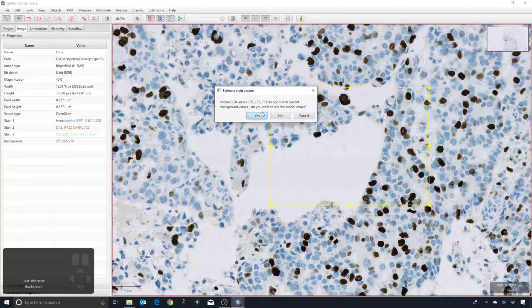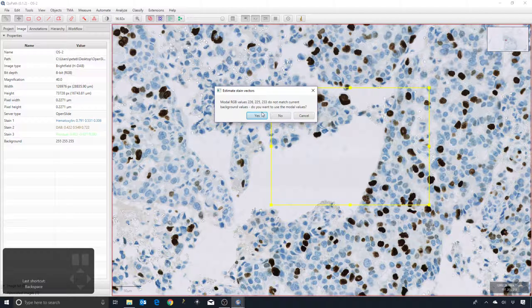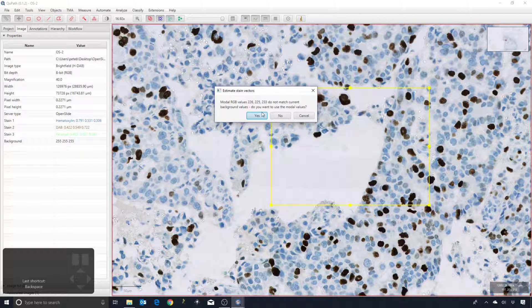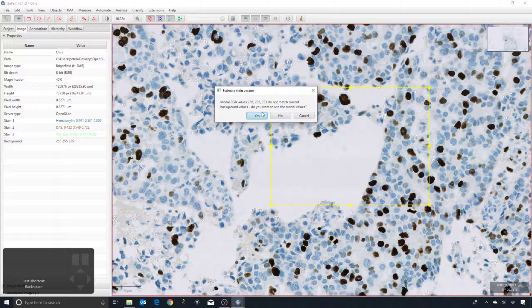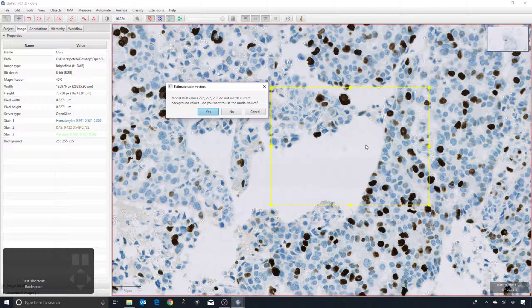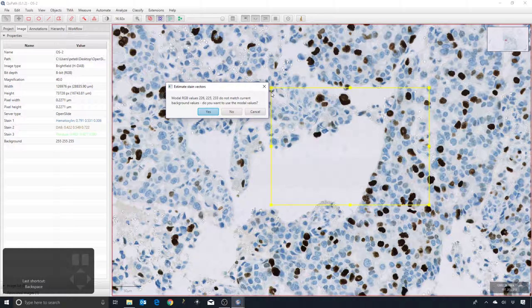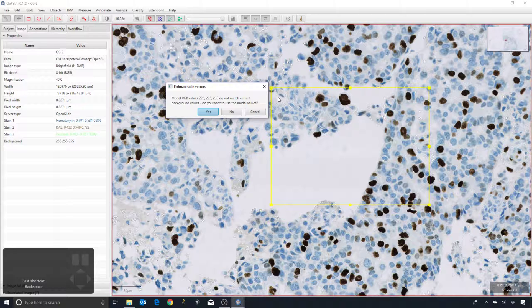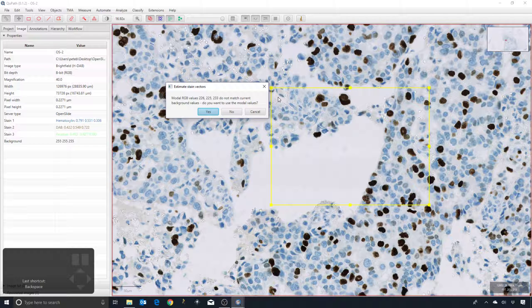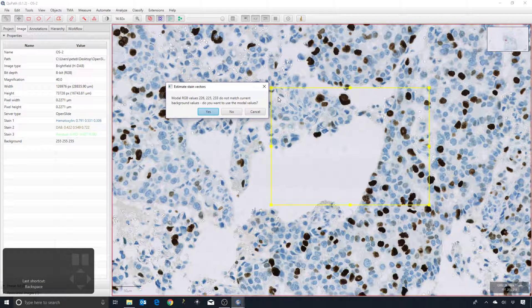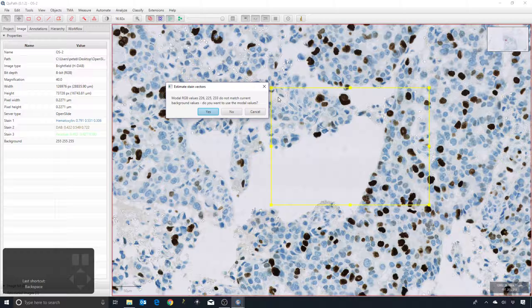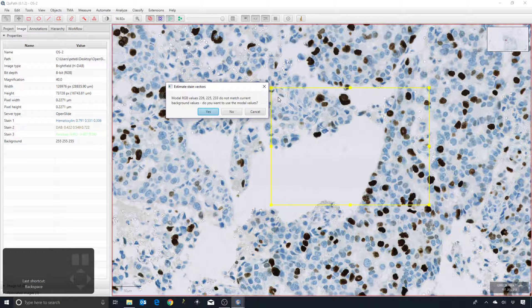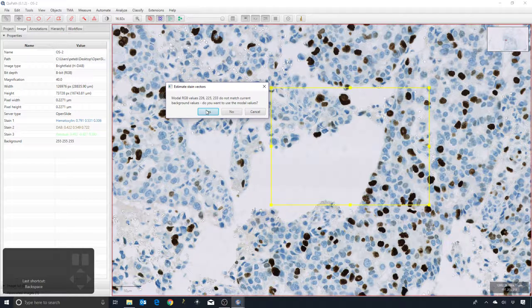The first question I'm asked is do I want to use the modal RGB values for the background. If we have a background region, then probably you want to say yes here. What QuPath is then going to do is it's going to take the most frequently occurring red, green, and blue values—remember for every pixel we have a red, green, and blue value—it'll take the most frequent for each of those and use those as an estimate of the background. That's actually important for the color deconvolution as well. A caveat that I need to mention is that these background values aren't incorporated in QuPath cell detection in version 0.1.2, which means that it might not perform so well if you have particularly a darker background. But that's something that probably will be incorporated in a later version of QuPath. In any case, I'm going to choose yes here.